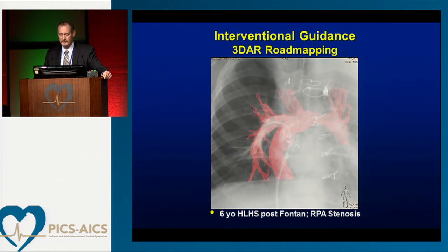Here's an image after the stent has been placed, again showing that using this for guidance, either catheter manipulation or device delivery can be helpful.